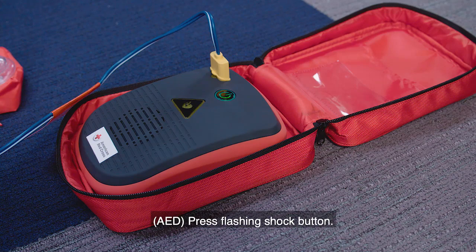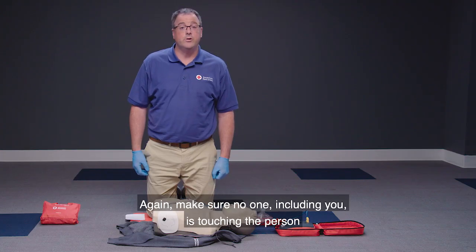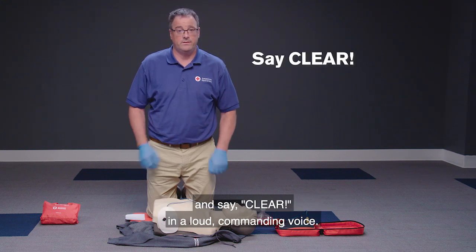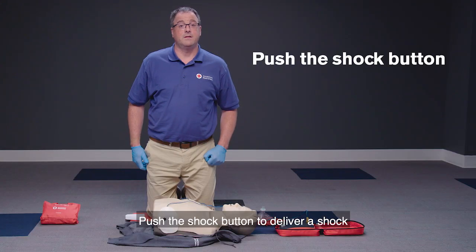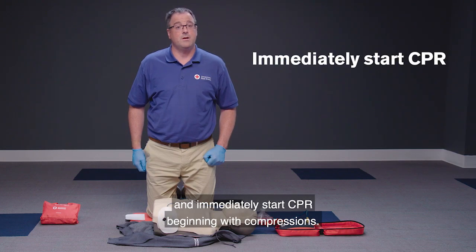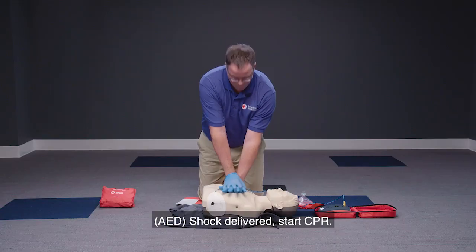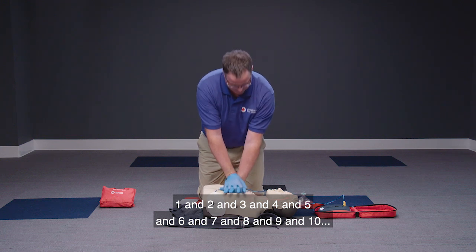Be ready to deliver a shock if the AED determines one is needed. If shock is advised, press the flashing shock button. Again, make sure no one, including you, is touching the person and say 'clear' in a loud, commanding voice. Push the shock button to deliver a shock and immediately start CPR beginning with compressions.